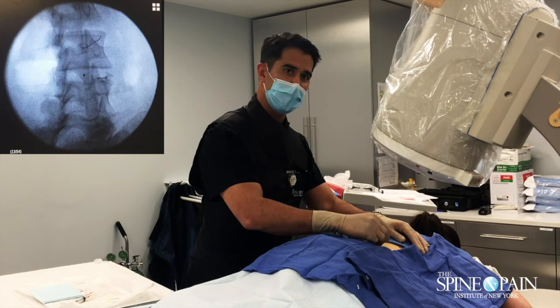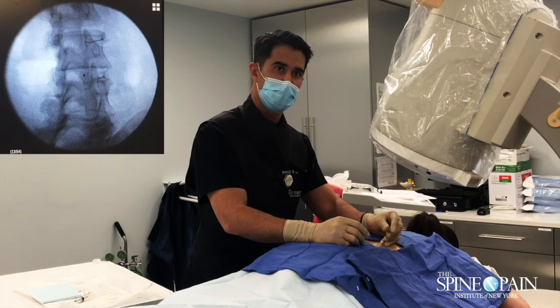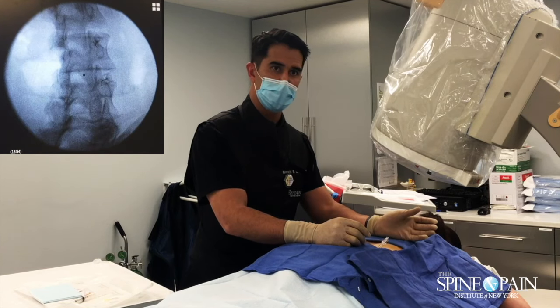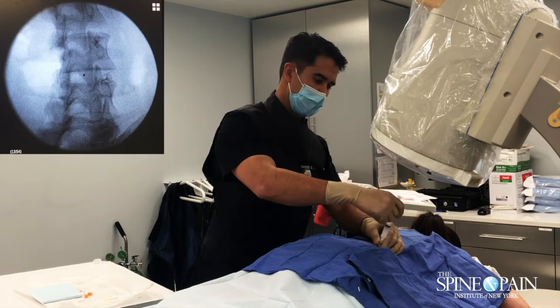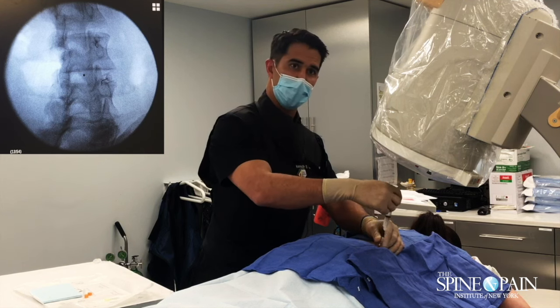Almost done. The end point of our needle is the bone, and you can see at that level where that is. A little bit of medication — that is numbing that nerve, that innervated joint.